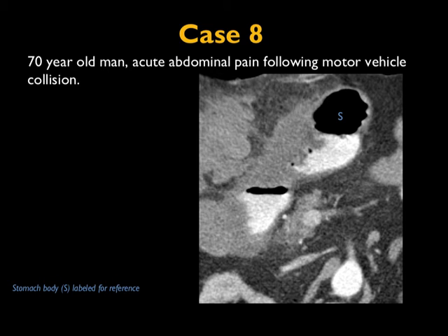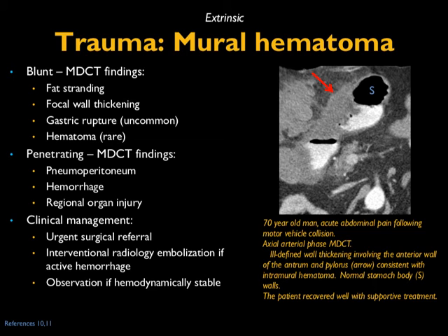Another case: patient with acute abdominal pain following an MVA. You might look at this and say the stomach is abnormal — could this be an incidental carcinoma? In fact, this was an intramural hematoma — a new finding in the setting of trauma. You can see the stomach involved in blunt trauma, though other organs are more commonly involved. There's focal stranding and wall thickening. Gastric rupture is exceedingly rare. For penetrating injuries, you would expect pneumoperitoneum, hemorrhage, and regional organ injury. Surgical management is usually necessary; if there's active bleeding, embolization can be performed.